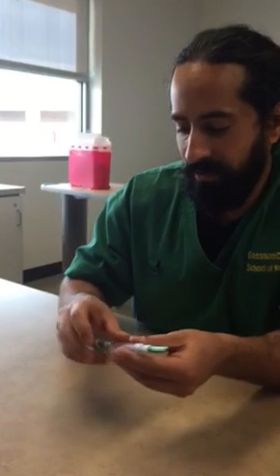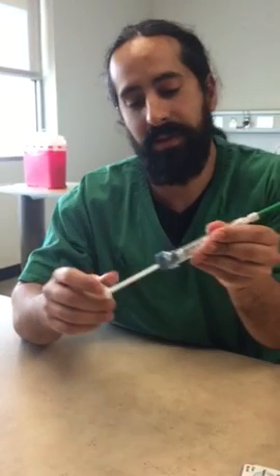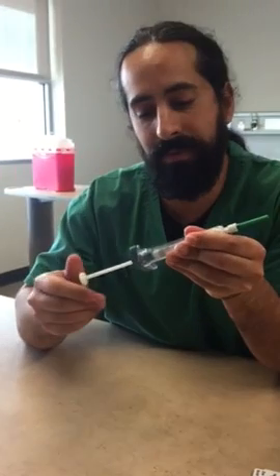We're going to put the vial inside the CarpyJet. We're going to turn this here, then we're going to thread the plunger up.